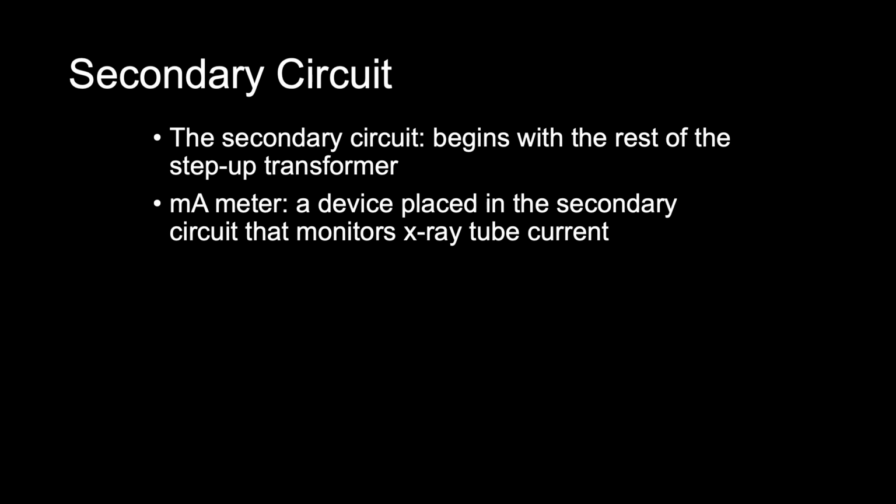In a general X-ray circuit, AC is necessary for transformers to operate correctly, which means they are providing the moving magnetic field. To allow the X-ray tube to be exposed to AC would be disastrous. So we need direct current. Within the X-ray tube, the current must always flow from anode to cathode and electrons from cathode to anode. So we cannot have alternating current. We have to have direct current going from anode to cathode at all times. So to achieve this, we have rectifiers that are used.